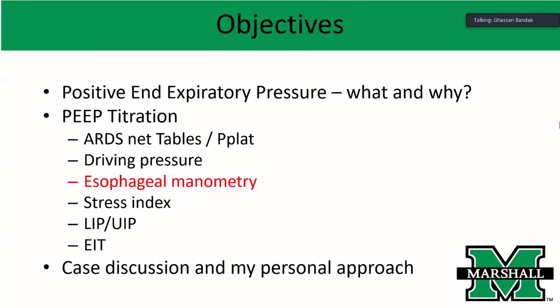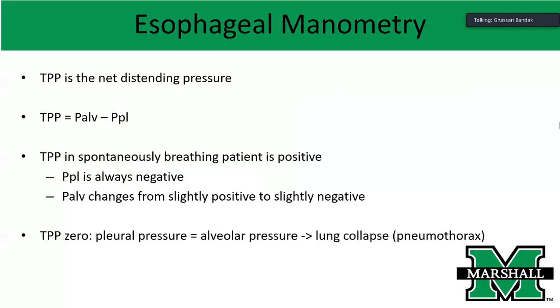So now let's move to esophageal manometry. Esophageal manometry is not commonly practiced or used, but we have it, we use it, and I think it's a very helpful device, okay?